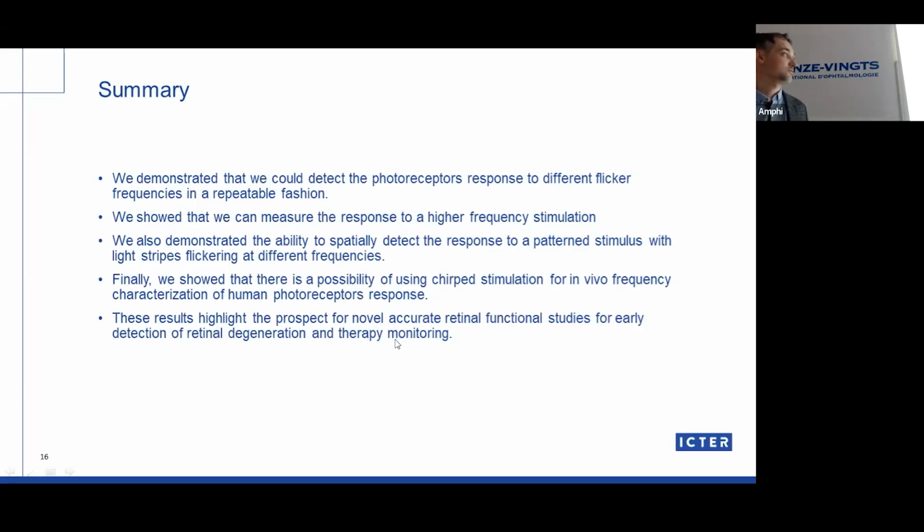But I have to hold on this because now we measured only the samples that are ready to measure. So volunteers from the lab who know how to focus, know how to maintain proper position, so they give us the stable signal. And now we'll be trying to switch to other subjects and check if we can do also this measurement in a proper way, and we can get proper signals.